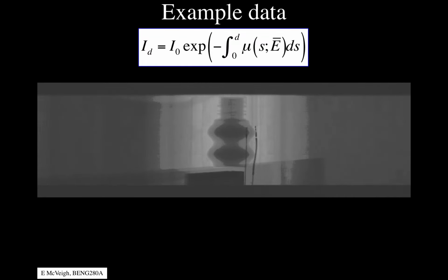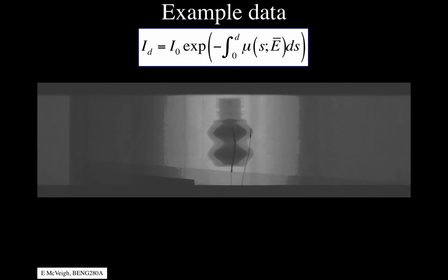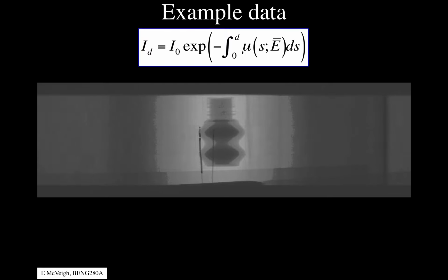As that detector is rotating around, this is what it's measuring. Now, this data is not corrected at all: not corrected for intensity of the emitted radiation, or for the difference in amplification on the different detectors and things like that. This is just what came out of the scanner. It's raw data, pure raw data.